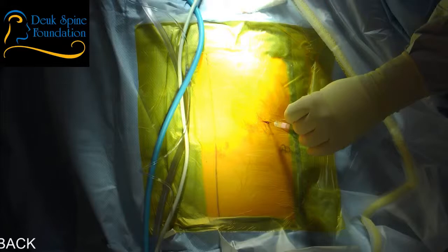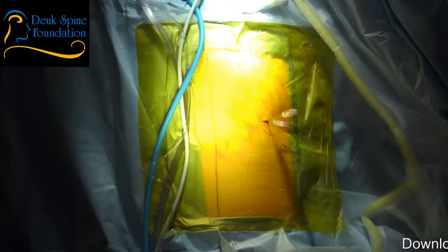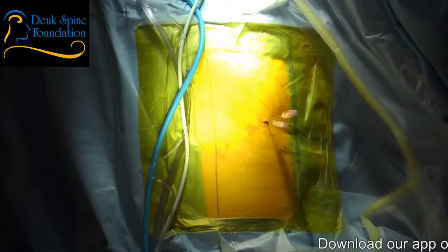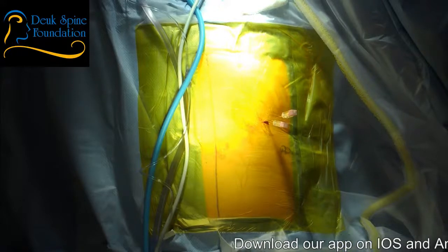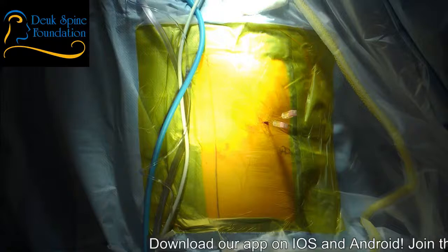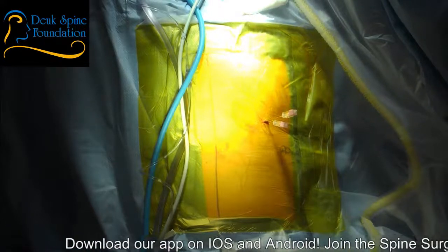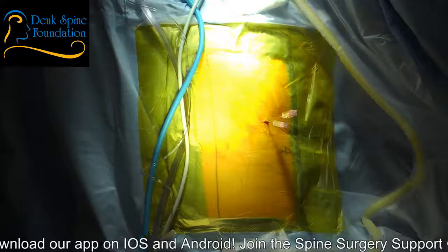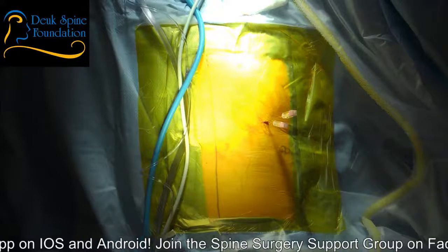Let's see a little more wag. I think we're missing something here. The pedicles of the bottom vertebrae are not lined up properly. Let's see if we can line them up. Nope. Other way, I think. Why is it important to line the pedicles of the bottom vertebrae up? Because that's really the surface you're using to orient the position of the needle.